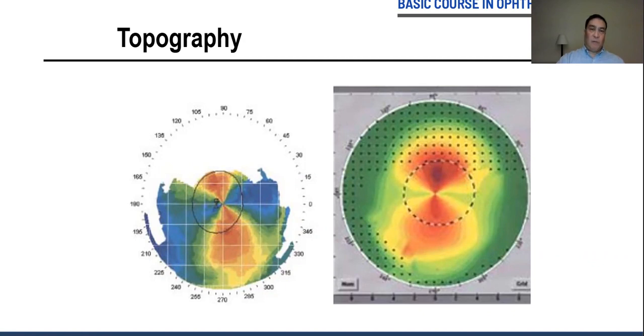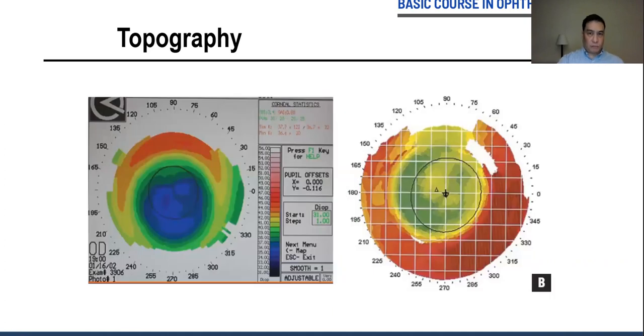If you see this, have the image repeated. If you are forced to interpret this, it'll still end up being very inaccurate. So just to avoid any trouble, just have the reading repeated, because obviously they were only able to scan at least half or a little bit more than half of the entire corneal surface.